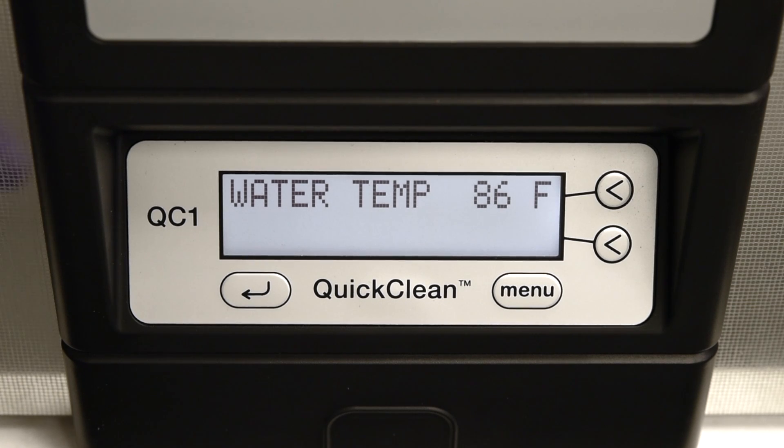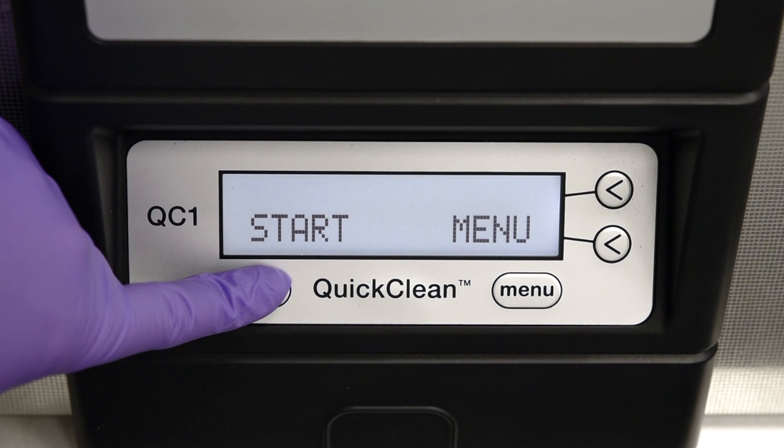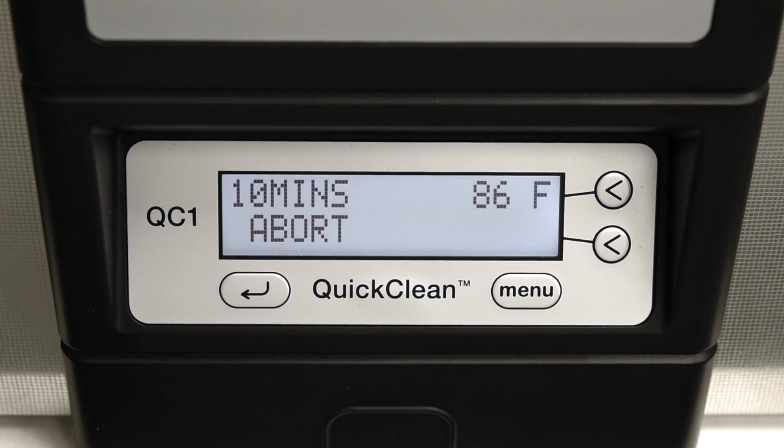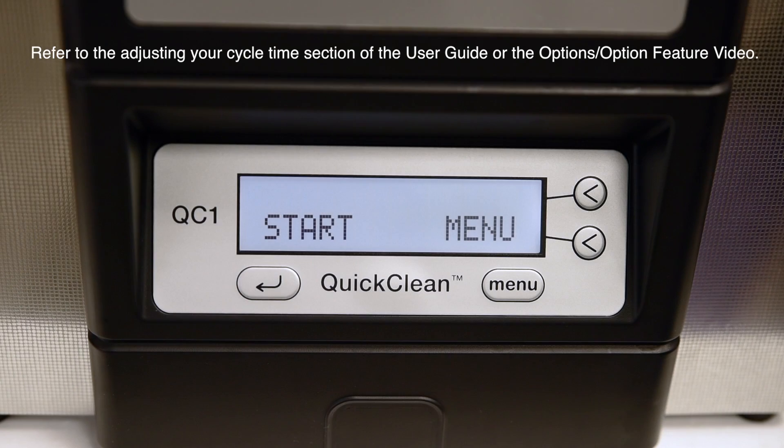Your ultrasonic unit has been pre-programmed with a cleaning cycle time of 10 minutes. Some components may take more or less time to clean effectively depending on the contaminants and the level of contamination. To adjust the cycle time, refer to the adjusting your cycle time section of the user guide or in the options video.